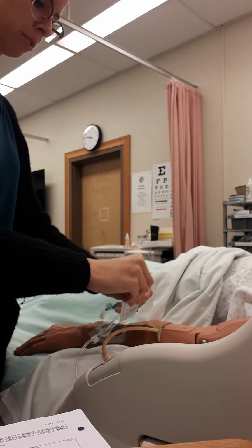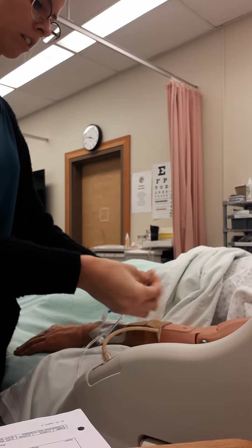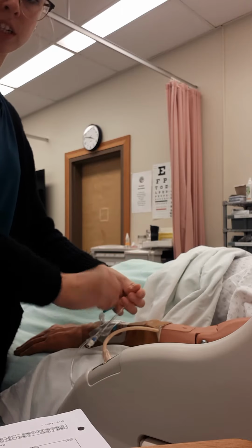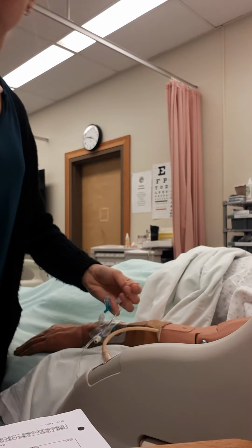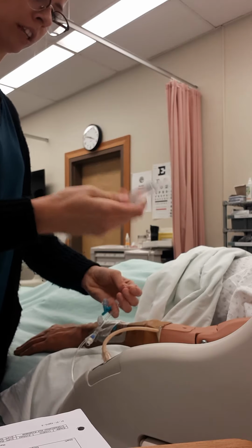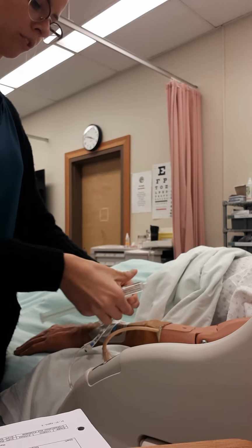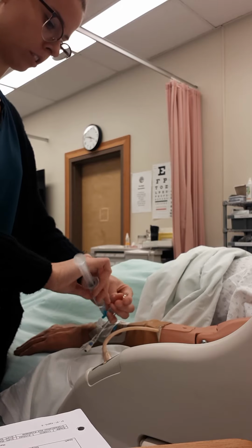Now I'm going to take a new swab. And I'm going to clean the port again for 30 seconds. And now I'm going to do my flush of normal saline. So first, I am going to hook that up.